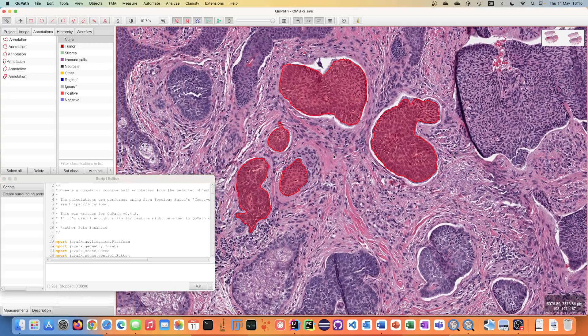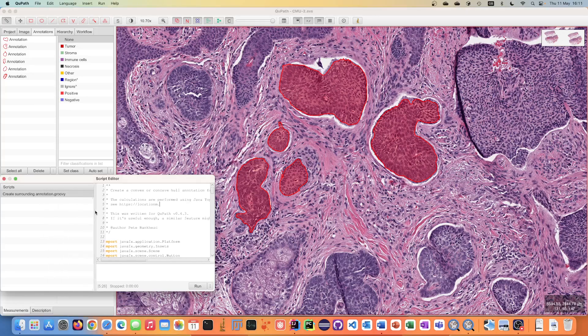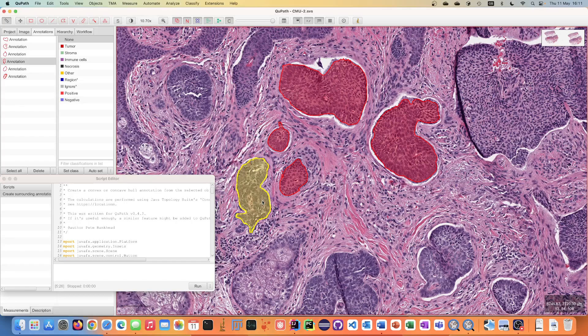Hi there. This is a quick video to explain a new QPath script called Create Surrounding Annotation. It was written for QPath 0.4 but it might become a feature in the software in the future if it's useful.